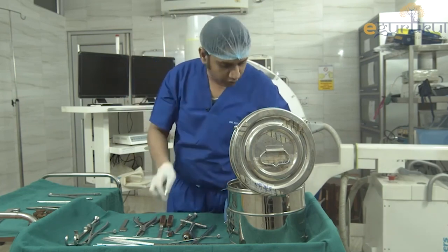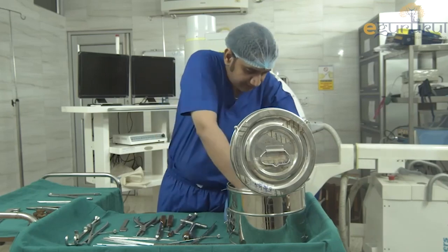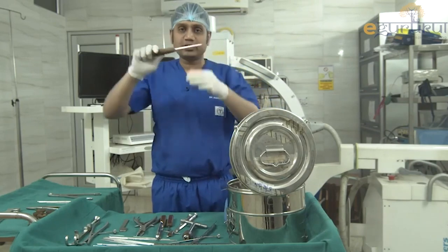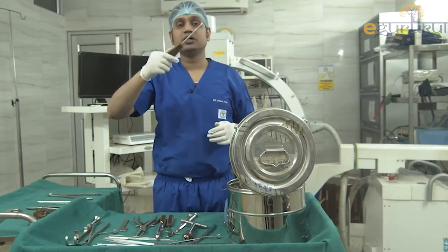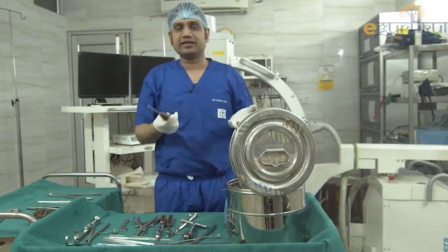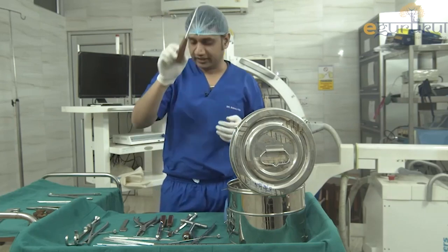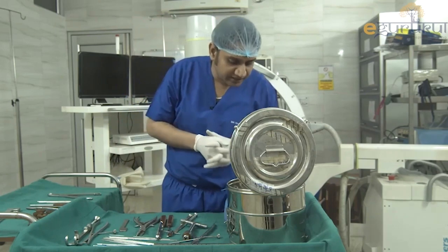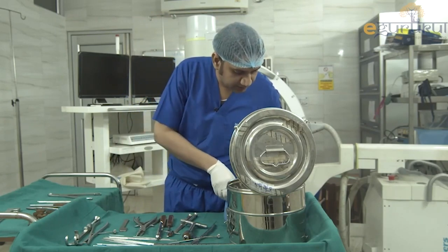Next is the screwdriver — used for tightening, loosening, or removing screws from bone. These are the instruments of a simple orthopedic instrumentation set.